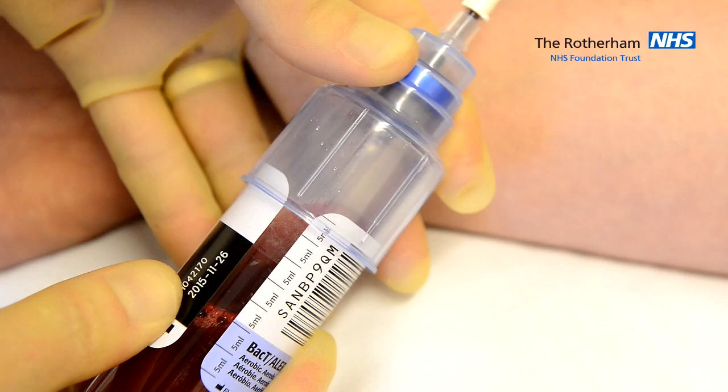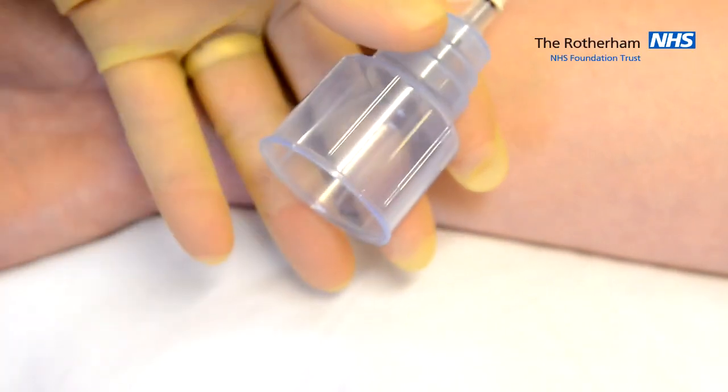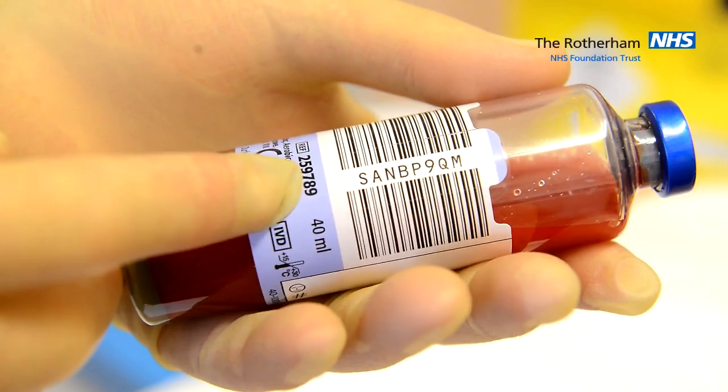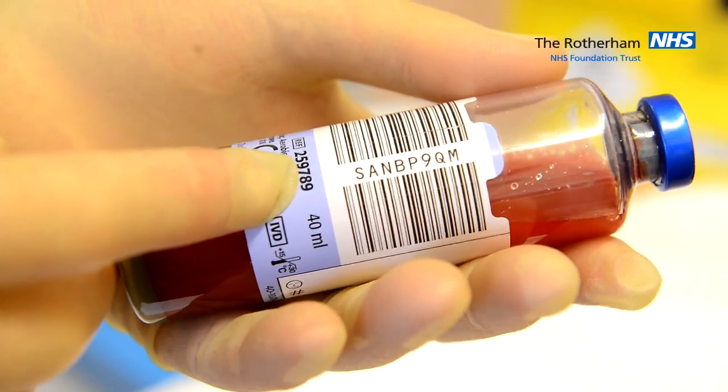Fill the blood culture bottle with 5-10 ml of blood. Do not remove the barcode label or obscure the barcode with an addressograph label.